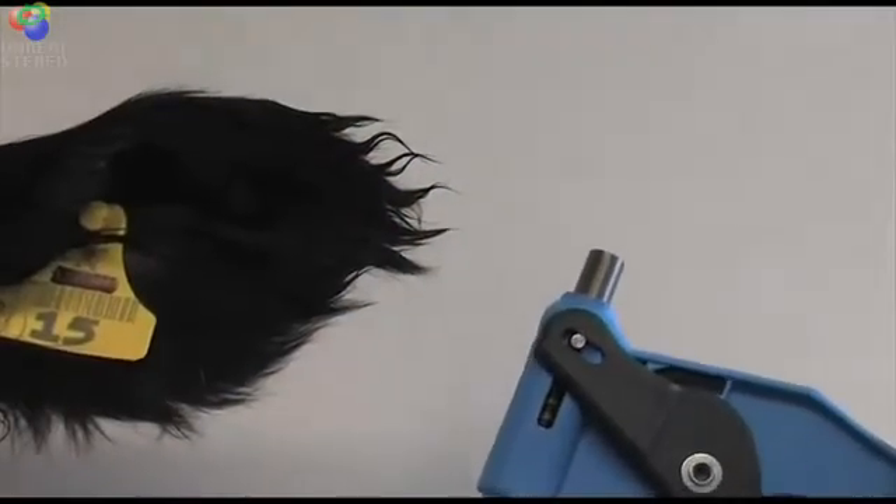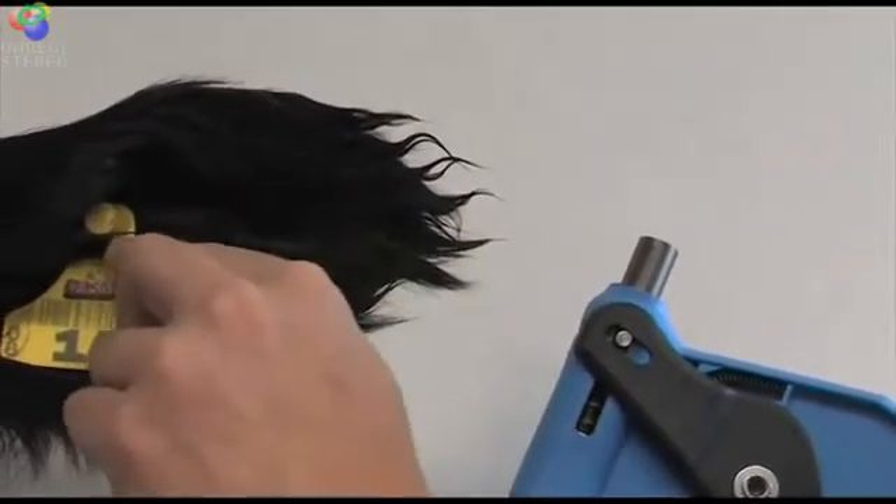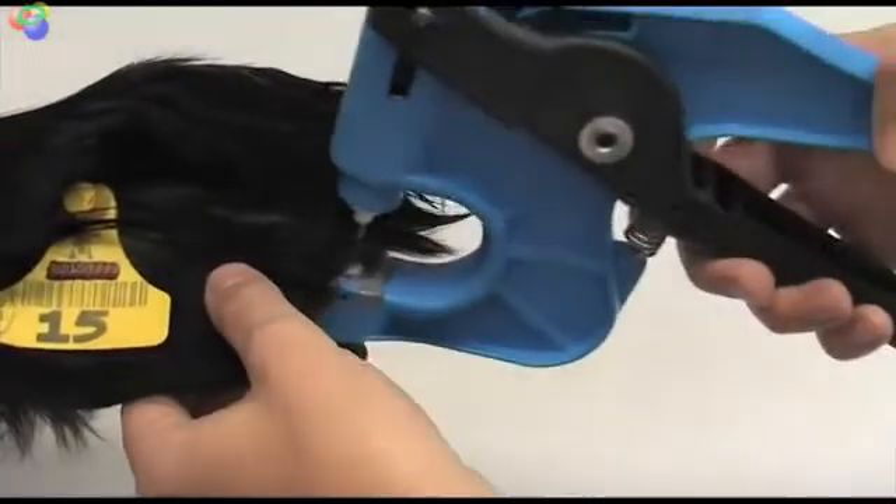When taking a sample, aim for the last one third of the ear, one to two centimetres away from the edge of the ear, avoiding any veins or ridges and the tag.